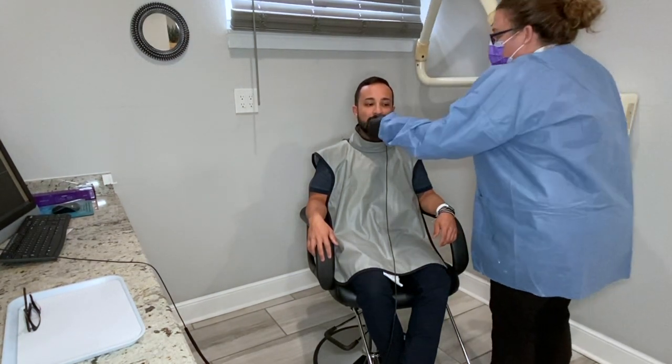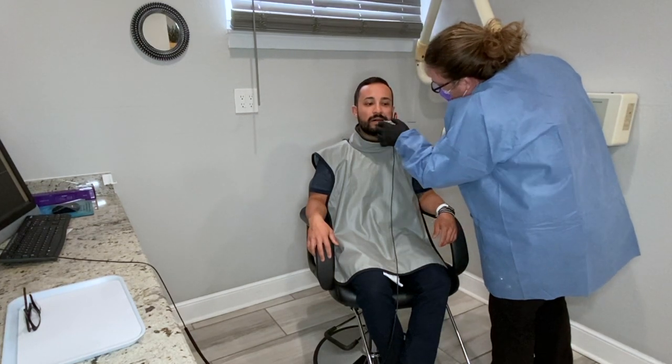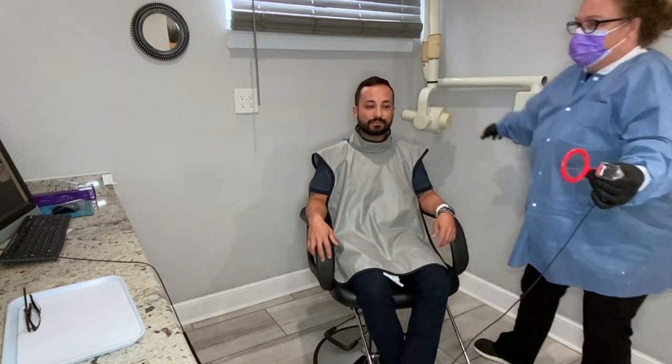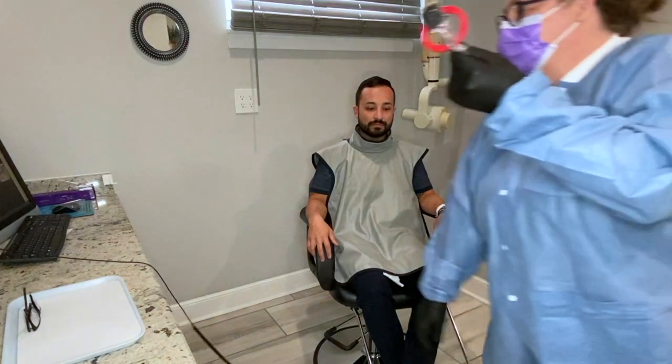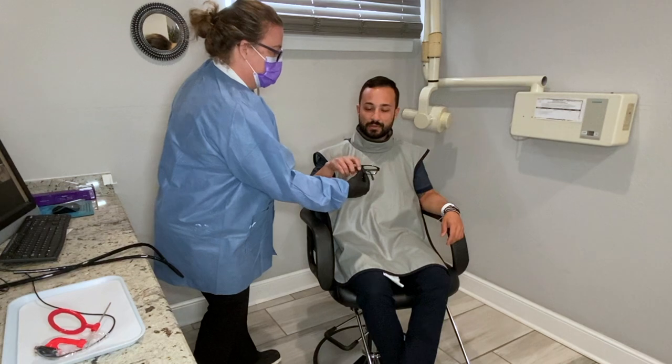Good, you're doing awesome. Open for me — need to breathe. We're going to go straight back, make sure we get the distal of this last molar. Make sure he's biting all the way down — teeth are closed, not open. Take his last one, great job. Open for me, push this out of the way, and put this up here. Have his glasses on.